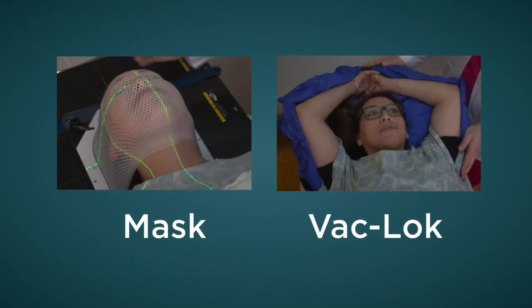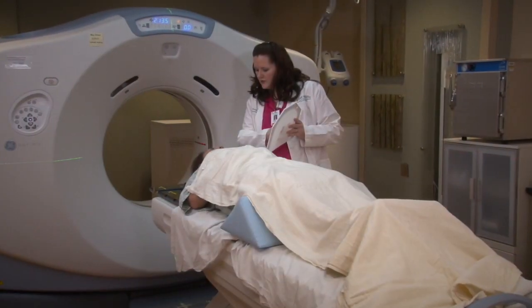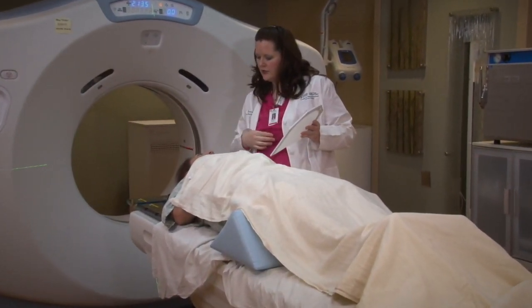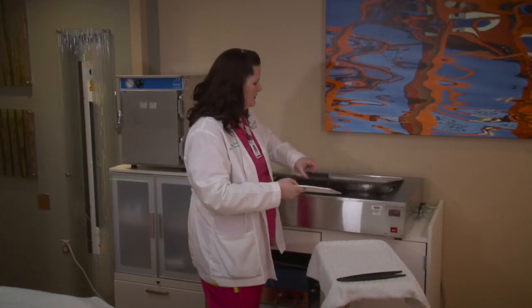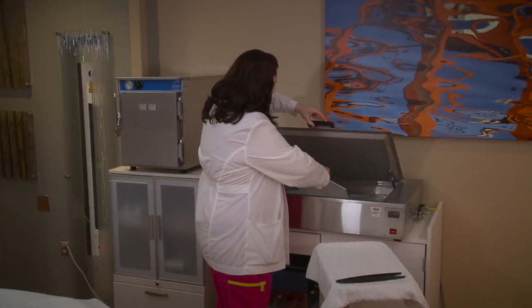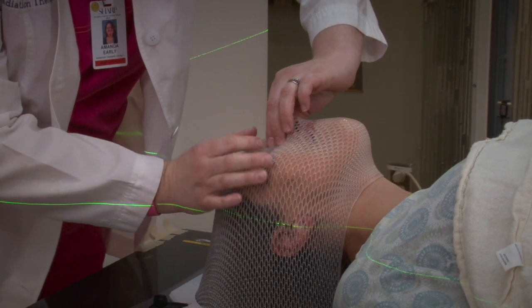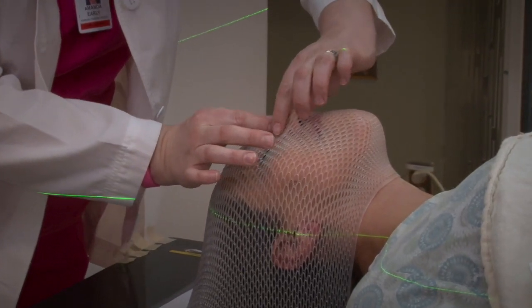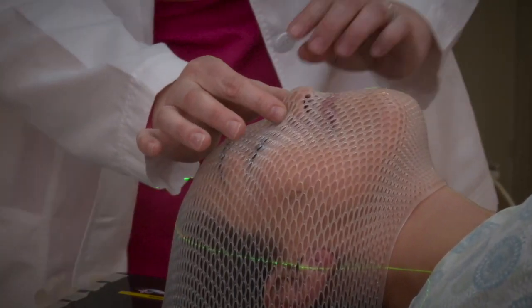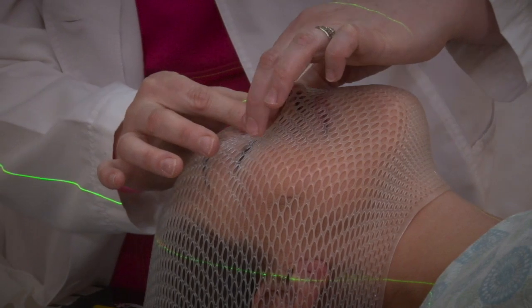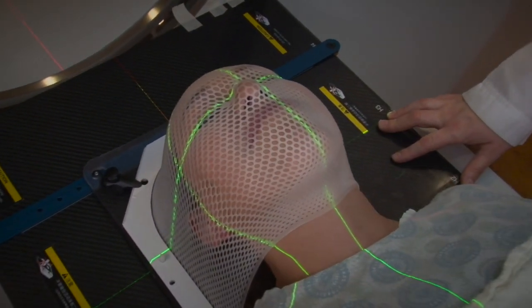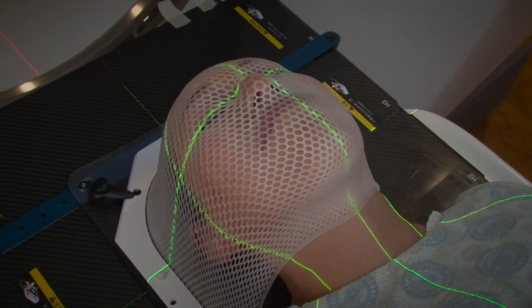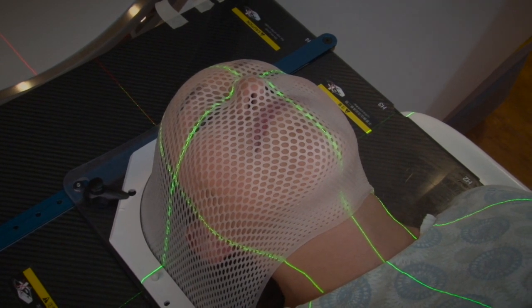Let's first take a look at the mask. If your treatments are near the head and neck area, we will use a mask. To shape the mask, we warm the plastic in warm water, then stretch it over your head and neck. Because the mask has holes, you will be able to breathe and see through it. We clamp the mask to the table in order to hold your head in the same position every time for your treatments.